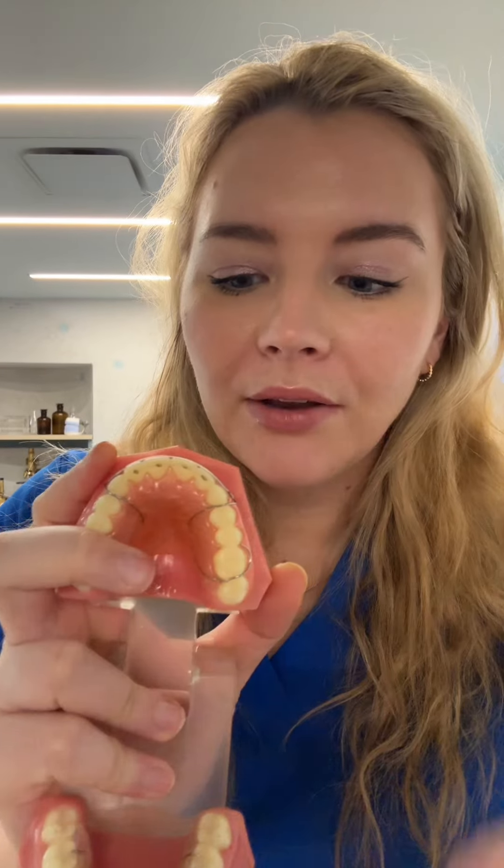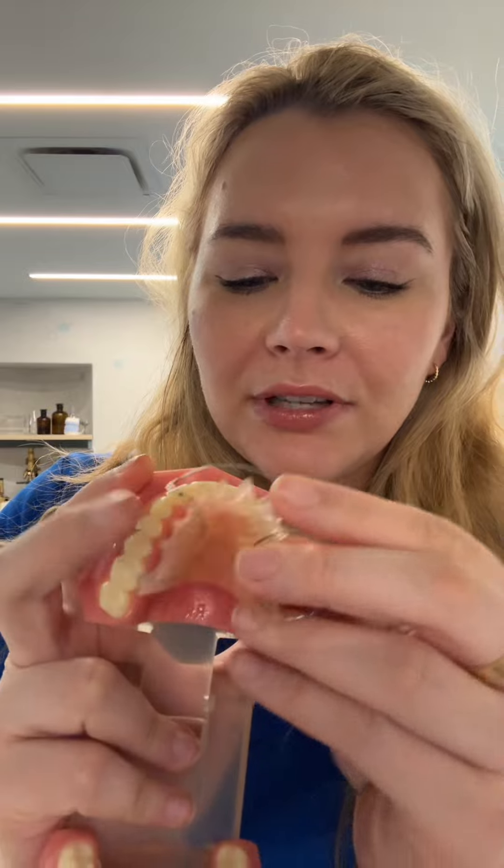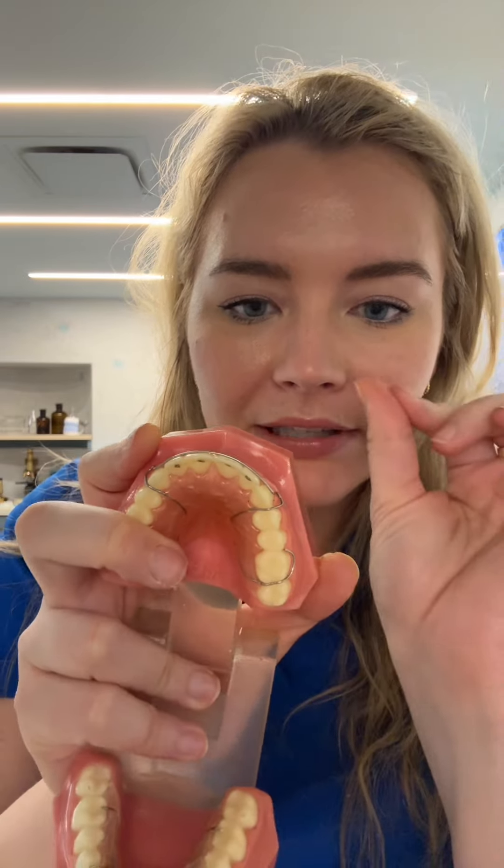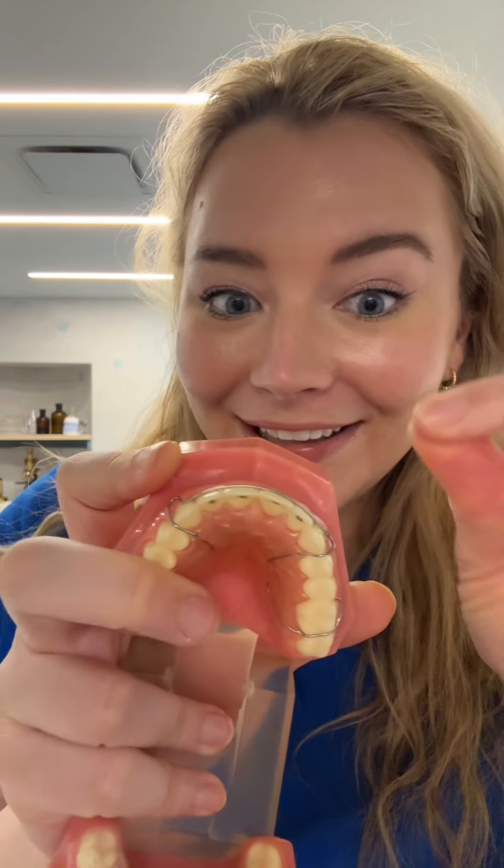Number two is that it doesn't hold the rotations on the front of the teeth as well. What I mean by that is you just have the resin right here and then you have the wire, so when you put it on the teeth like this, these teeth still have a tiny bit of space where they can slightly turn and cause your teeth to not be as straight as they were when you got your braces off.